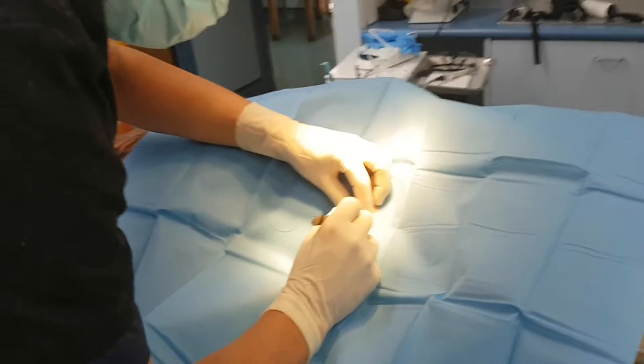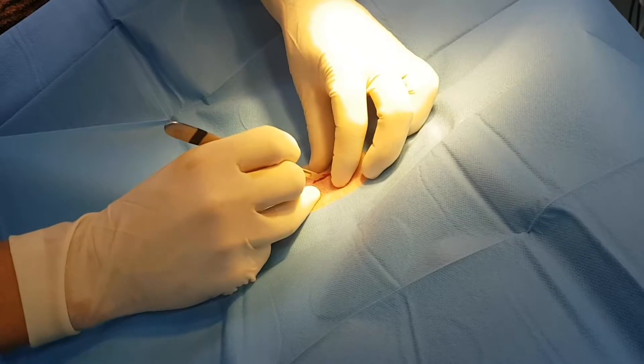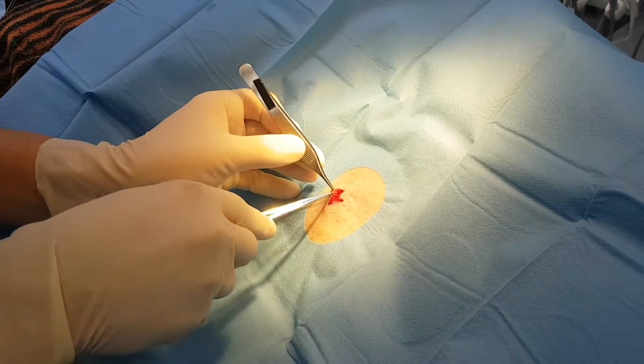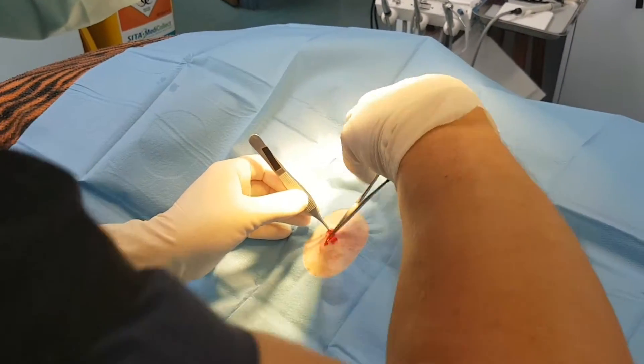Just going to cut in here and hopefully we'll find a grass seed nice and quickly. Just do a bit of a cut down over the infected area. We've got the abscess here — you can just see a bit of pus starting to come out.